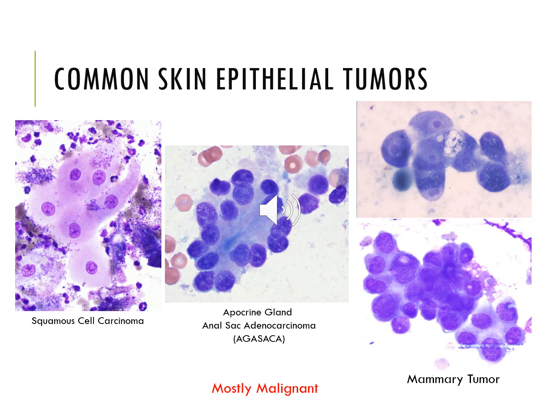They don't exhibit marked criteria of malignancy typically cytologically, but they're always pretty bad. So these guys don't tend to metastasize as readily, but they are very locally invasive. And when they do metastasize, they typically go to regional lymph nodes via the lymphatics.